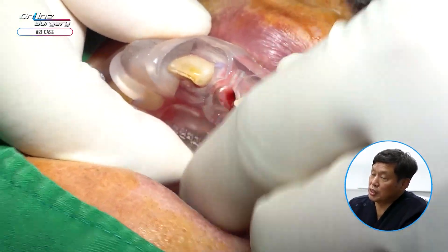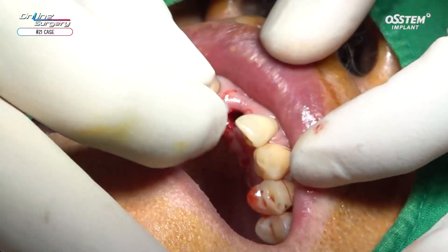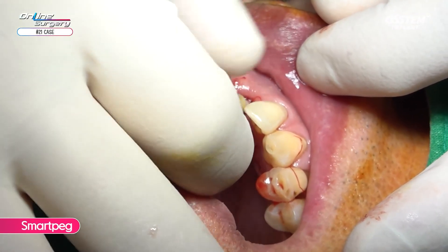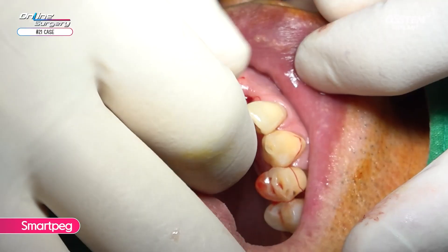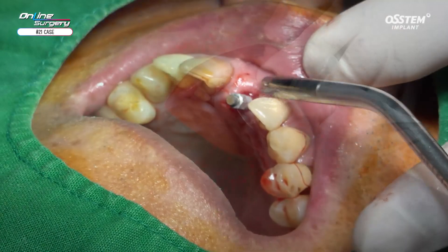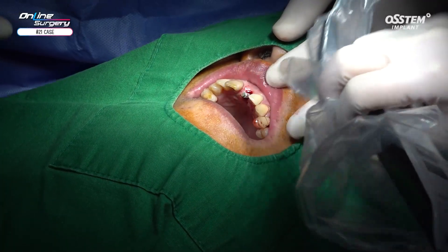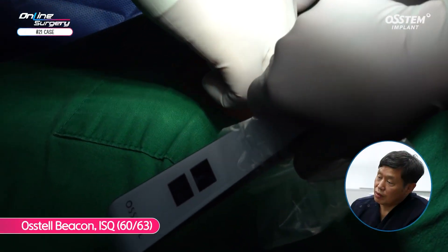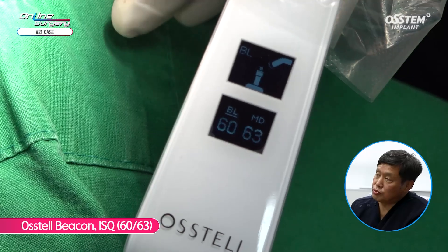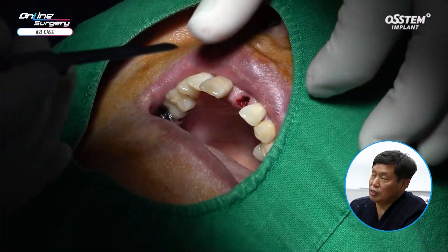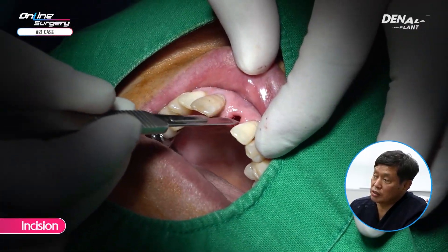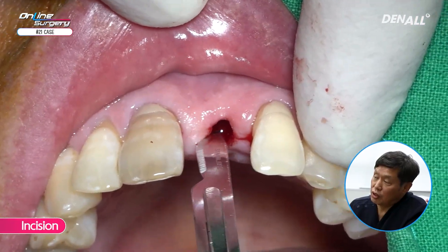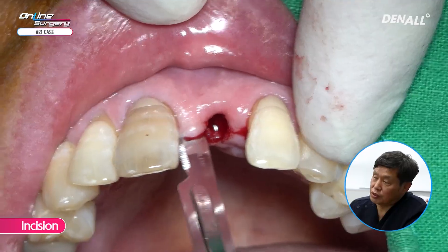This made us think that the primary stability might be slightly insufficient. The ISQ value was around 60 to 63, so while we originally considered placing a temporary restoration, we decided to make a minor incision and perform a dual zone grafting technique on the labial side.